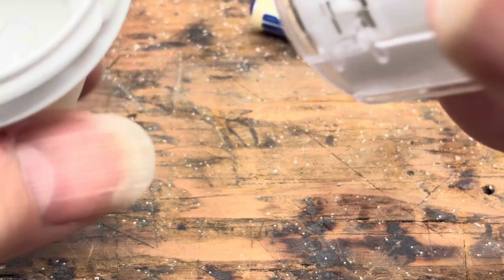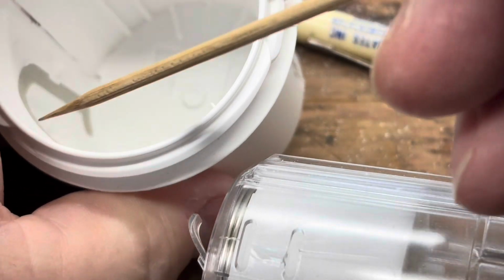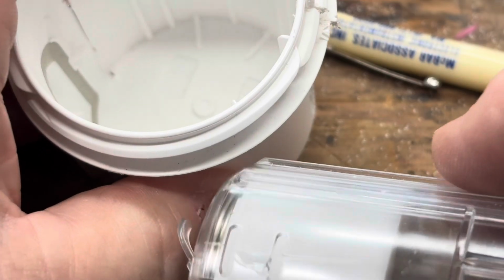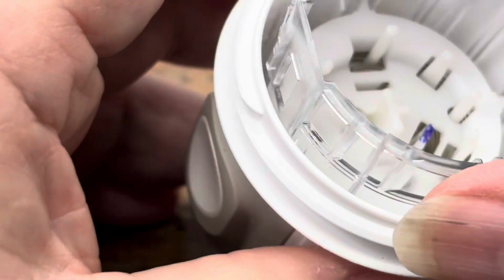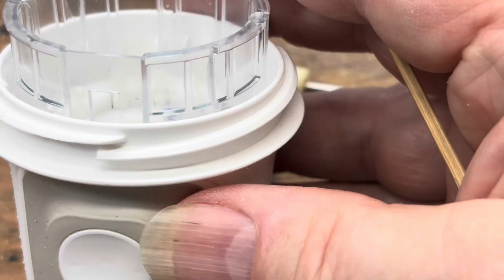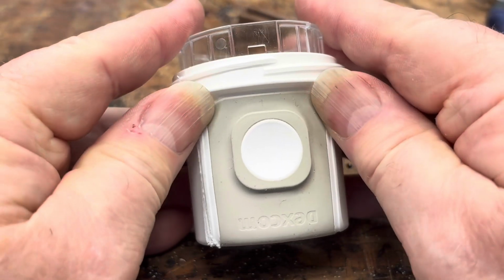So now I'll put 2 back into 1. The tabs here on 2 are going to hook onto the tabs down there in 1 so that it can't fall out unless you know what you're doing or you sawed cup 1 in half. Okay, slide it in. Slide it in, you'll hear it click.